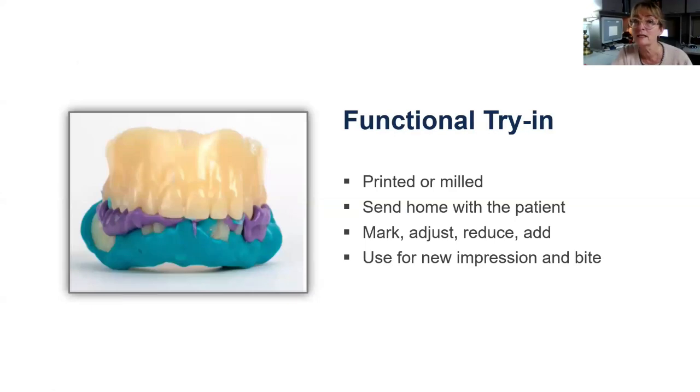This particular case, the patient was sent home for 2 days and they experienced the denture. The maxillary denture was fantastic. There was no need to make any adjustments. On the lower, they felt there could be additional retention. I'm not surprised because that initial impression was just a scan, right? There was nothing to displace the tissues. So we did a wash impression on the mandibular functional try-in and then set the bite.